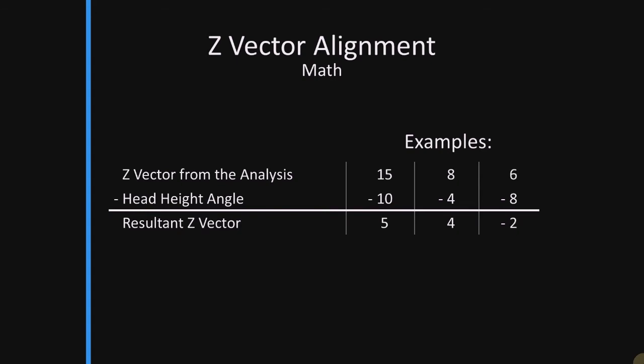And if we had a height vector from the X-rays of 6 degrees, but our patient's side-lying body position was 8 degrees, then we would actually have to set the z vector of the instrument in an inverted negative 2-degree instrument setting in order to give a plus 6-degree adjustment. You may be asking, if we have to invert the z into a negative setting, doesn't that complicate the application of our rotation? It does. You would have to invert the rotational coordinate in a negative z instrument setting. And we'll go over that in the next couple of slides.